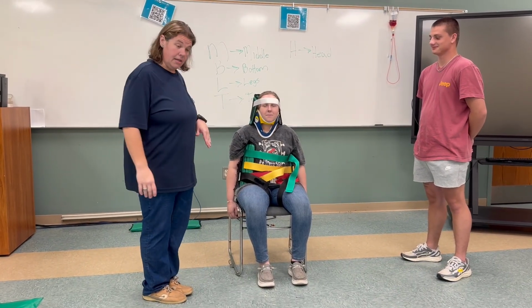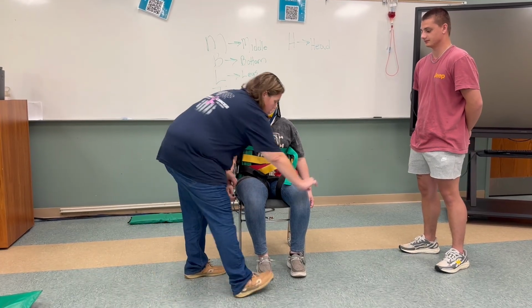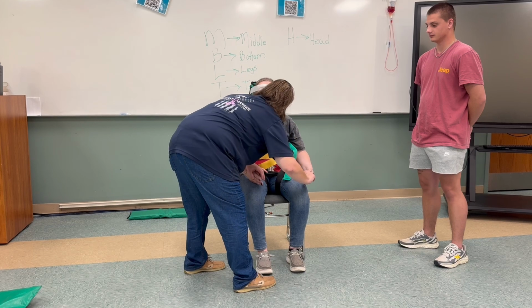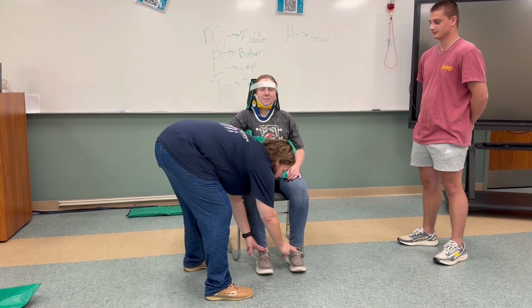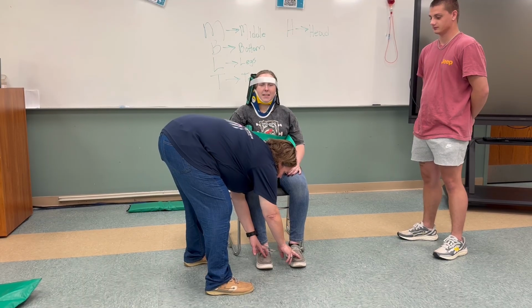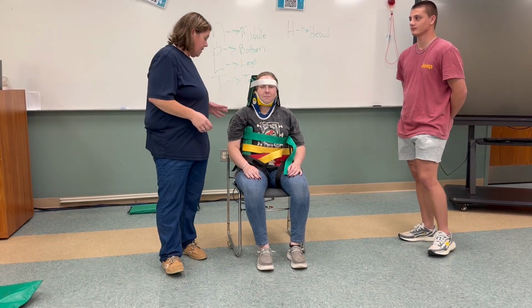After you fully immobilize them with the KED, you're going to go back and you're going to check PMS again. Ma'am, I'm going to check it again, okay? Pulse. Can you move your fingers? Can you feel? Yes. All right. Pulse. Can you move your feet? Can you feel? Yes. All right. Now we have got to the portion where we're able to move the patient.